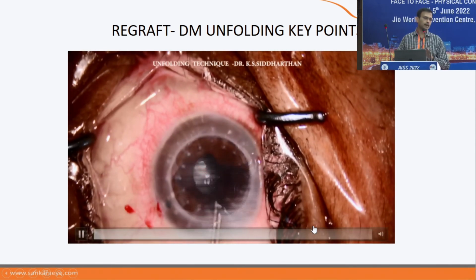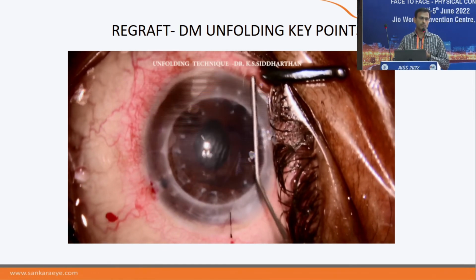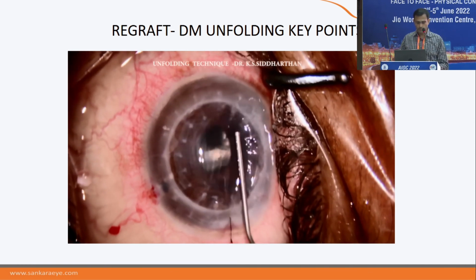Take the graft size lesser than your graft host junction. Maybe if it's 7.5, take 7.25 so that it easily unfolds and the barrier actually does not allow the DM to go out. Yeah, thank you.